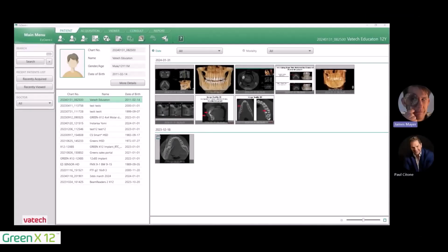So Paul, we just went through patient positioning on the cone beam here, and I think it's important to do a little bit of talking about CT image quality and evaluation. Would you agree? Yeah, absolutely. Taking a look at your images immediately after you take them is a great idea to verify you captured the proper anatomy and making sure everything looks the way it should. For sure, and the patient's still there, so do I need to retake the image because I've just evaluated? That's going to save a lot of headache for the office and the patient.